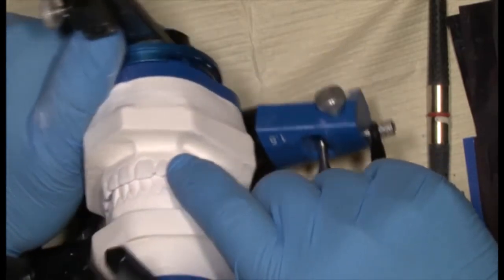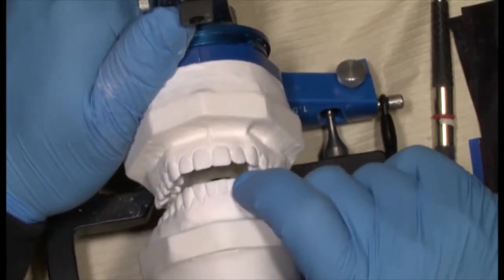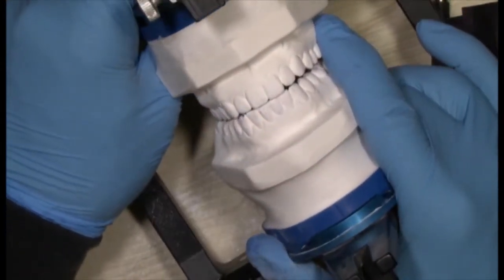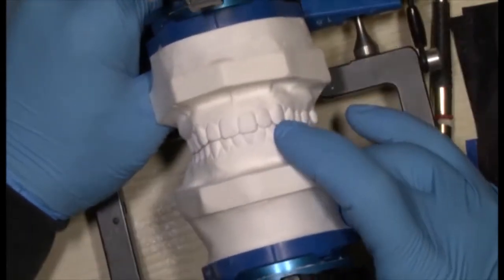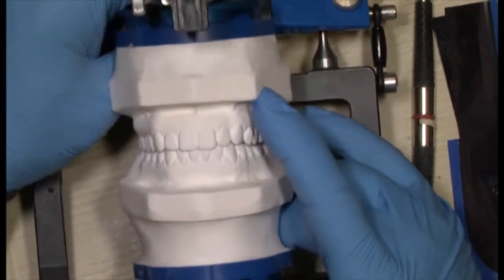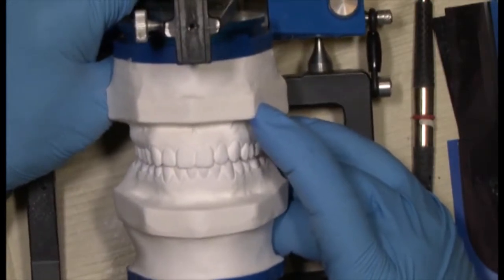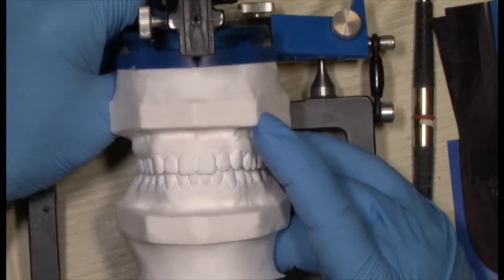It almost appears if I do much more, I'll have to start to relieve the back of the maxillary anterior teeth or the facials of the lower anterior teeth. Right here, it tells me at least I could get equal simultaneous contact on both sides, most likely a driveway on both cuspids, but at the very end, this may not be the only part of the driveway. But remember, if this patient has equal simultaneous contact that is very, very easy to get into, meaning that the brain doesn't require effort to find it, it can find where it fits very easily. The envelope will be very small anyway, and the requirements of a driveway will be minimized.